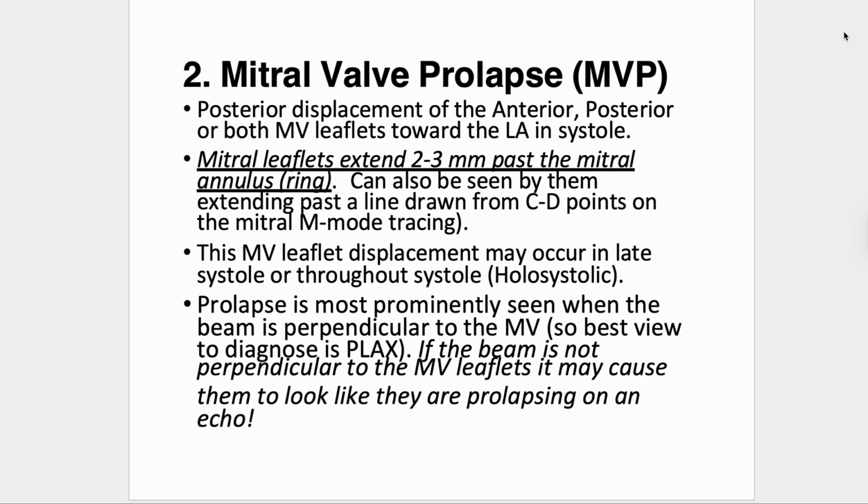Mitral valve prolapse. So what is MVP? This is posterior displacement of one or both leaflets towards the LA in systole. Right, I'll show you what that looks like.